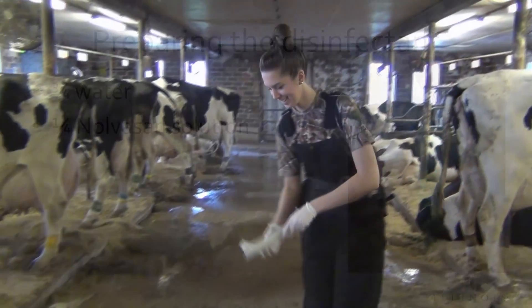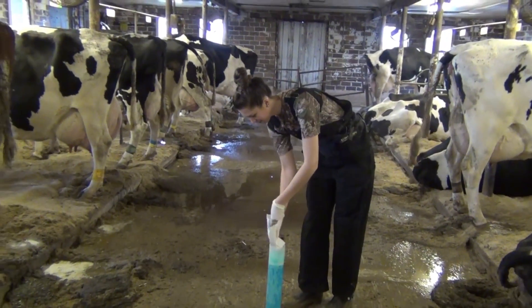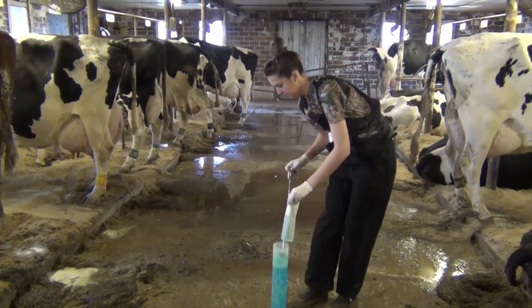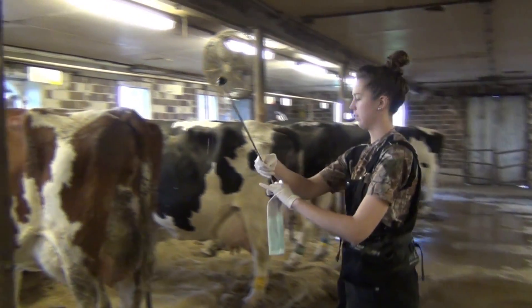Next, dip two paper towels halfway into the Novosan solution and remove the MetroTech device. While you are approaching the cows, make sure that you do not touch the end of the MetroTech device to any of your surroundings.